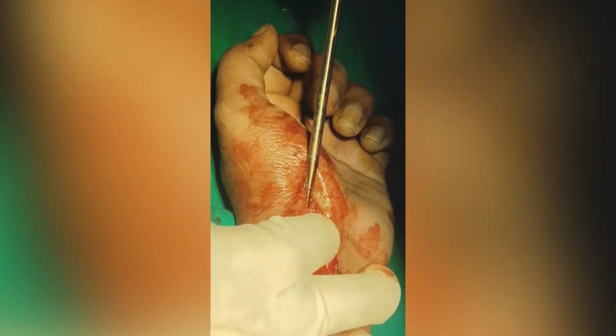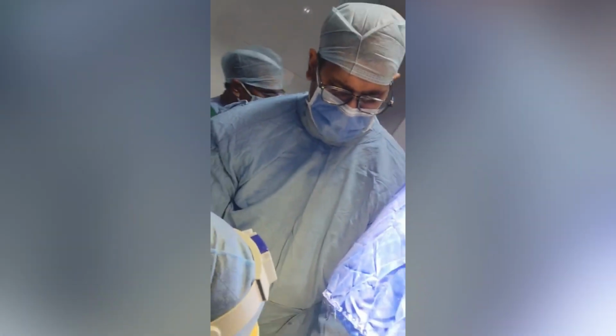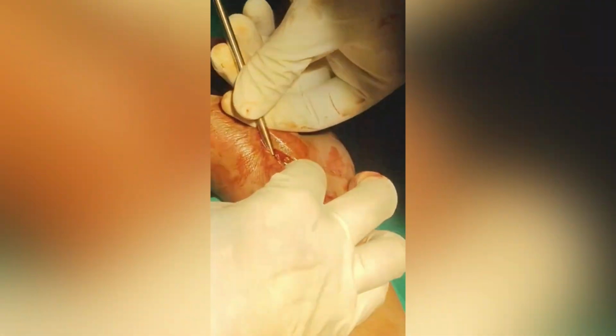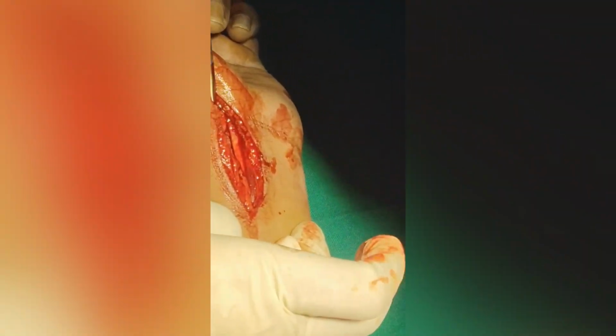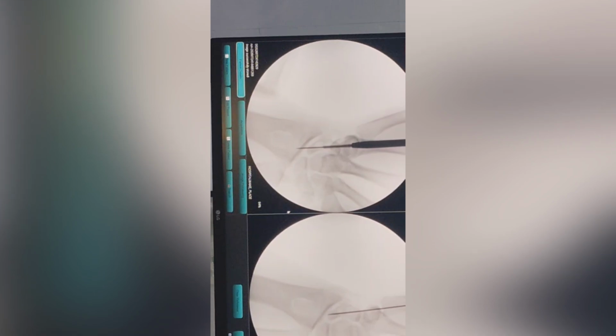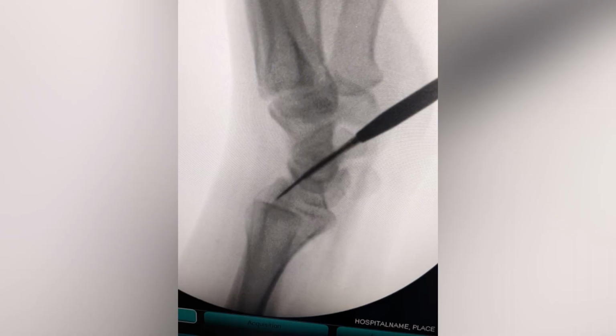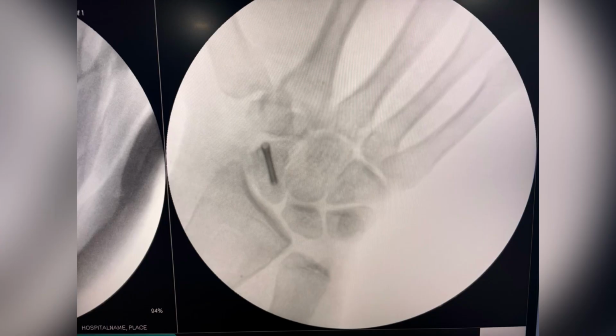As you can see, I am thoroughly fixing the screw, trying to put it within the scaphoid bone, and later I can visualize it and confirm the proper reduction under C-arm. Here you can see proper placement of the scaphoid headless screw within the bone in both AP and lateral views, and good compression with the bone graft placed in the center of the non-union.